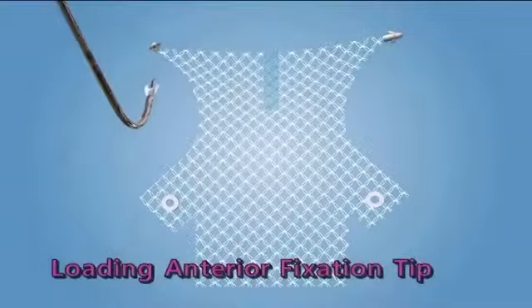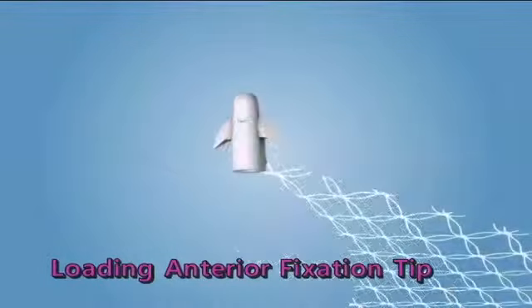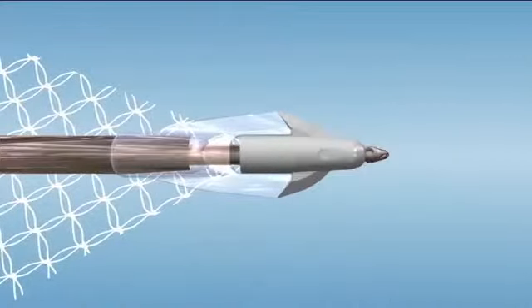Loading the anterior fixation tips. When loading the anterior fixation tip onto the anterior needle, a snap should be felt, indicating that the tip is fully engaged, which prevents rotation or disengagement during placement. Visualize the needle tip protruding through the distal end of the anterior fixation tip.